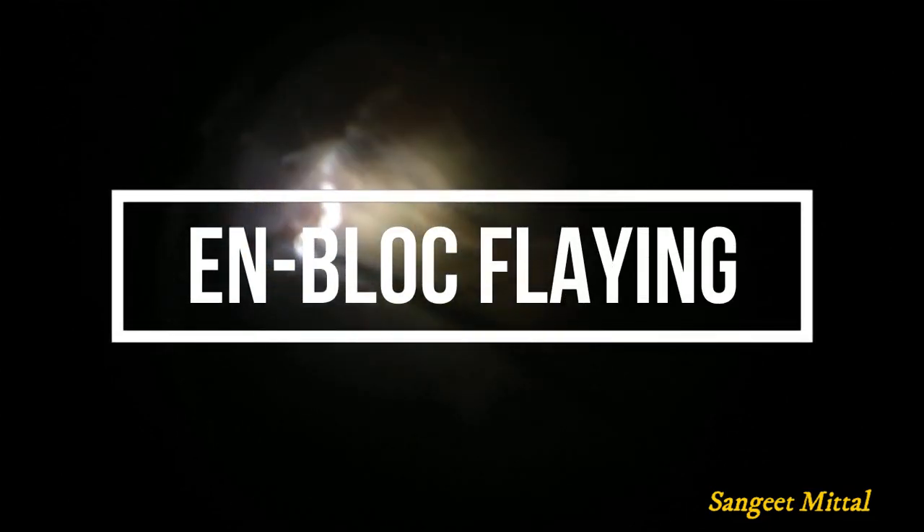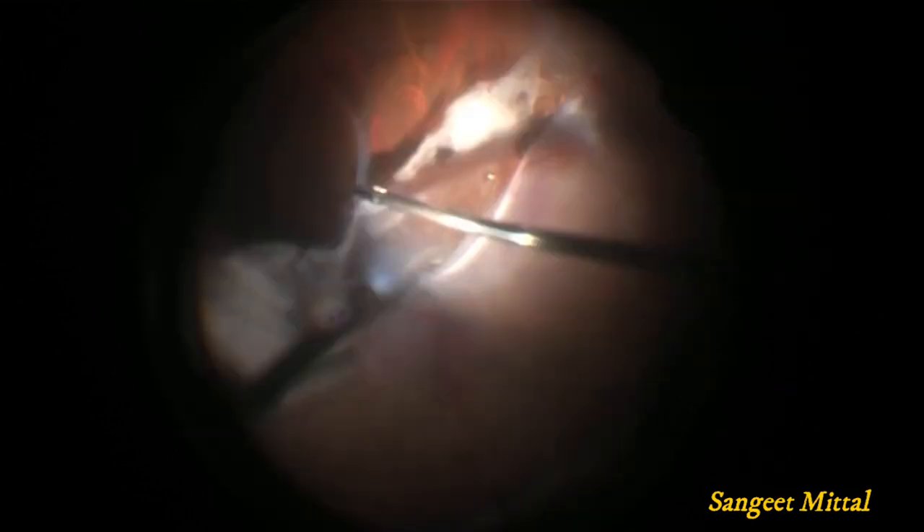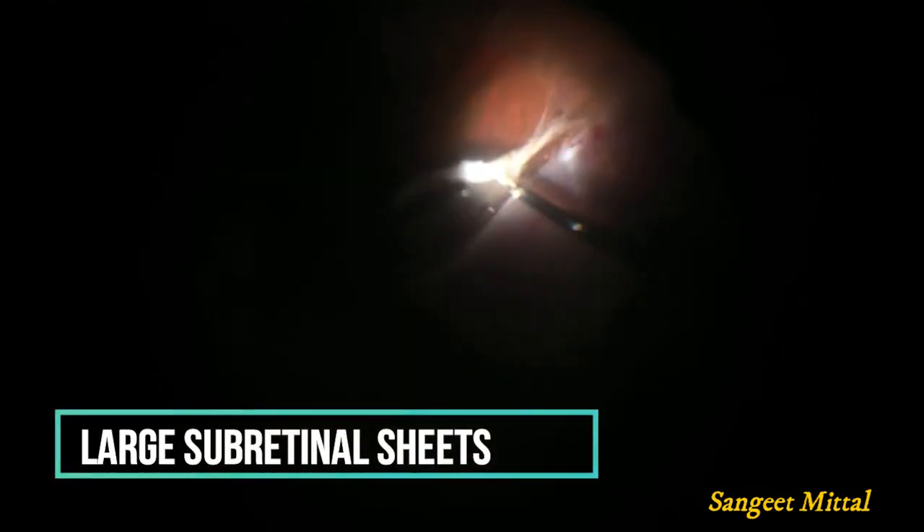This was a patient with a large subretinal sheet under the retina; a large retinectomy was created. When the undersurface of the retina was exposed, it was seen that the subretinal fibrosis was loosely adherent to the retina at the edges only, but it was extending almost 360 degrees below the retina. A 360-degree retinectomy was done to fully expose the subretinal space. The subretinal tissue was then grasped from its posterior edge near the optic nerve head and peeled off from the retina en masse, in the manner as if the skin of a dead animal is flayed.